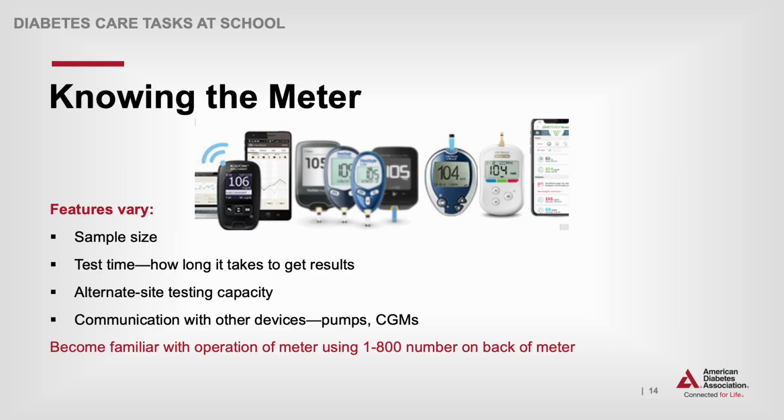There are many reliable meters on the market. Each has a unique set of features and operating procedures. A number of features vary from meter to meter. Some of the features are convenience-based, while others can be critical to accuracy of results. Features may include the sample size needed, wait times, or alternate site testing capacity.